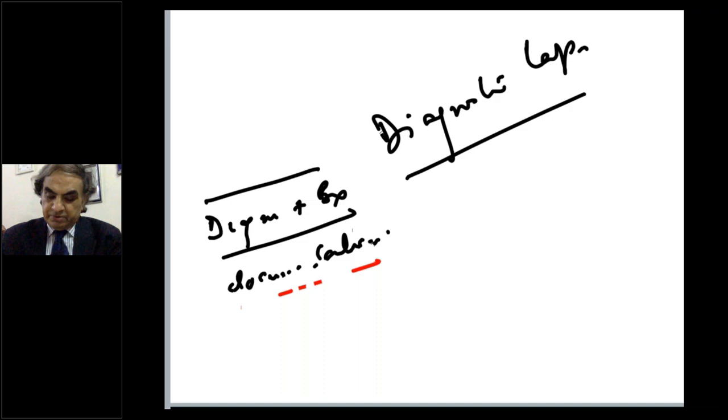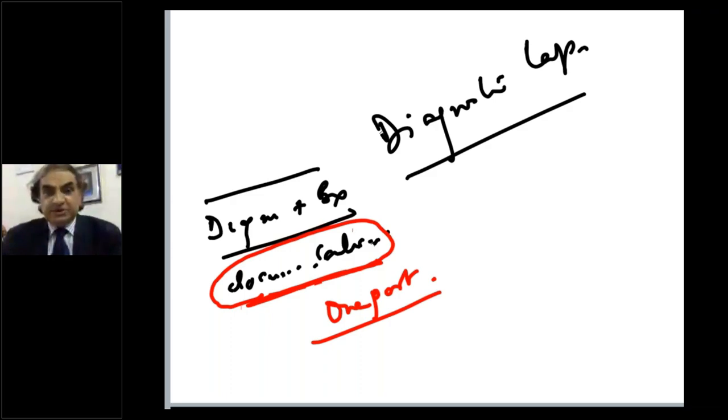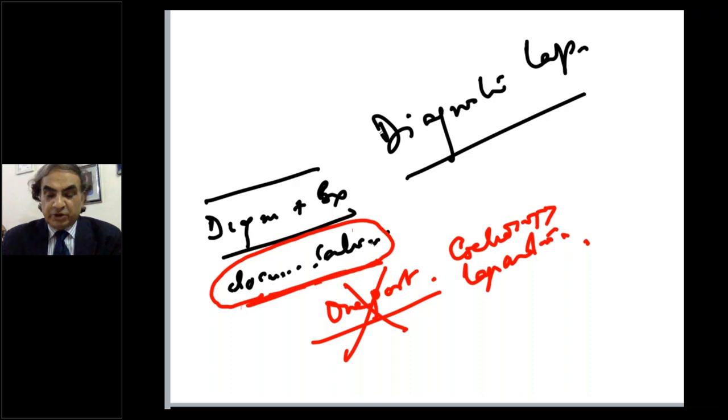...therefore done to make a diagnosis is what you would want to be considered as a diagnostic laparoscopy. If you just put one port, which is a very common mistake, and you say I have done my diagnostic laparoscopy, it will be a wrong statement. That is called celioscopy or just laparoscopy. You can always put in a scope. So first thing first, understand what it means.